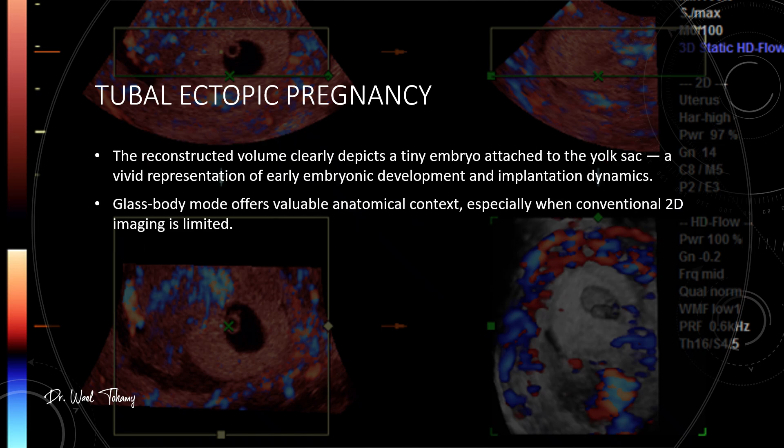In this reconstructed 3D volume, you can clearly see a tiny embryo attached to the yolk sac — a vivid snapshot of early embryonic development and how implantation occurred. Glass body mode gives us that extra layer of anatomical context, which can be especially valuable when 2D imaging alone doesn't provide the full picture. Always remember, when standard views leave you uncertain, 3D can be the key to unlocking these fine details.